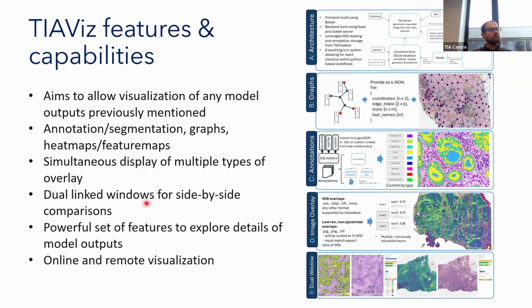It allows for dual linked windows to do side-by-side comparisons, or just to see an overlay next to the unoverlaid slide. And there are a variety of features to explore the details of the model outputs, and visualize them in various ways. And as I mentioned earlier, you can make online or even remote visualizations using this.